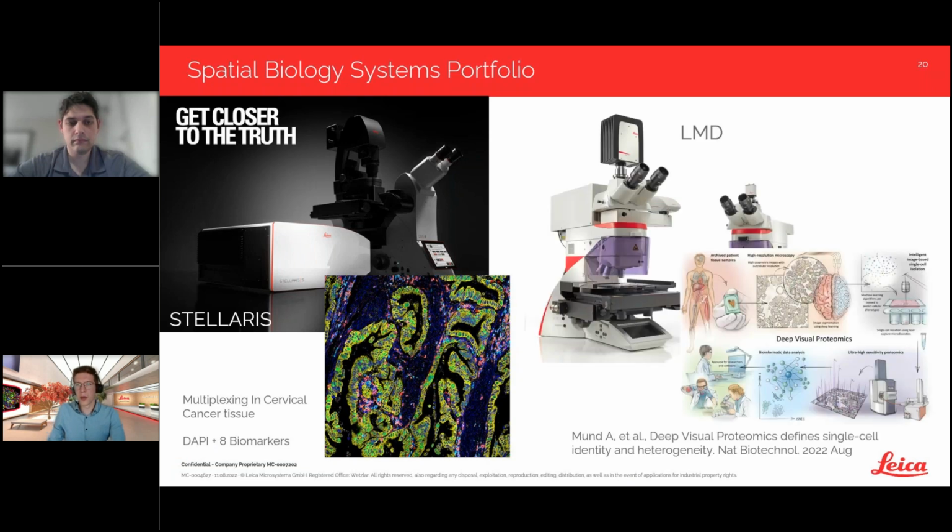Another system which is very useful for spatial biology workflows is our LMD, laser microdissection, which allows you to specifically cut out parts of your tissue for downstream analyses.